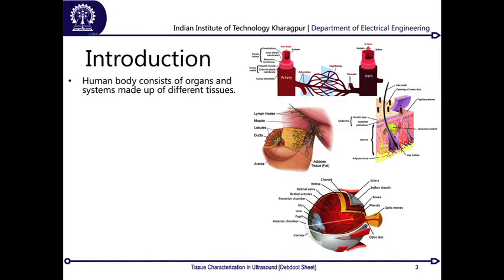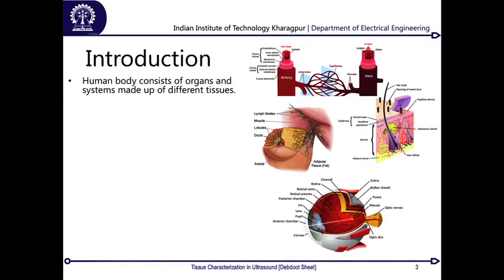We are looking specifically at these soft tissues, and since we are pretty much aware by now of the concepts of ultrasonic imaging, one of its best uses is imaging of soft tissues and finding soft tissue abnormalities and contrast between them, rather than hard tissue imaging, where the much more predominant modalities are computed tomography and X-ray. The other modality which is obviously used for soft tissue imaging is magnetic resonance imaging, but we are sticking only to ultrasound as of now for its flexibility.